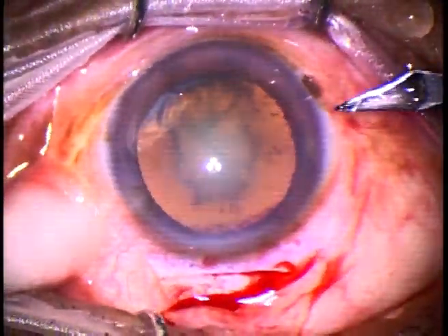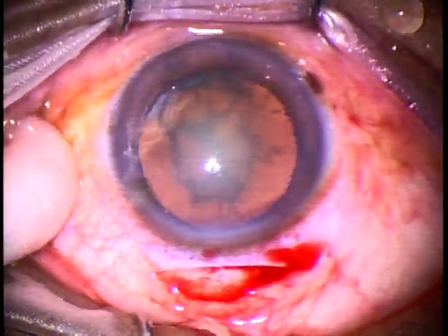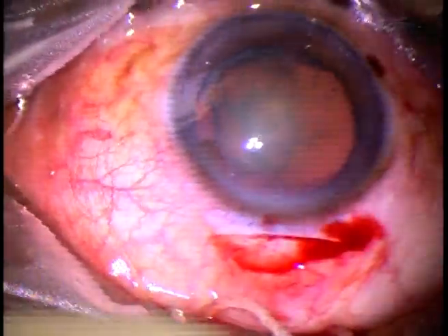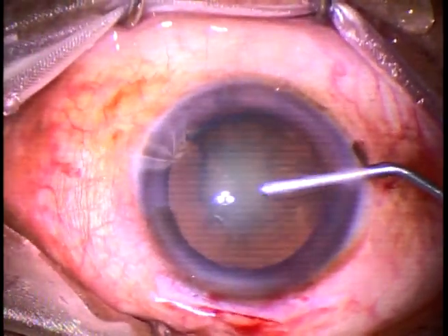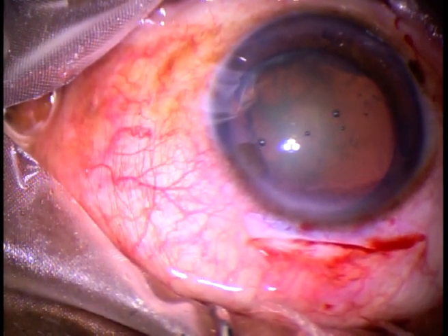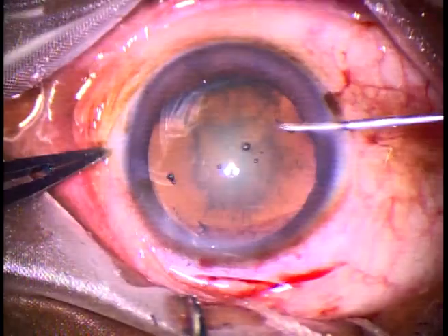Capsulorhexis is to be done. This is a side port of about 1.8 millimeter. With the help of a 26-gauge bent needle cystitome, the rhexis will be done.